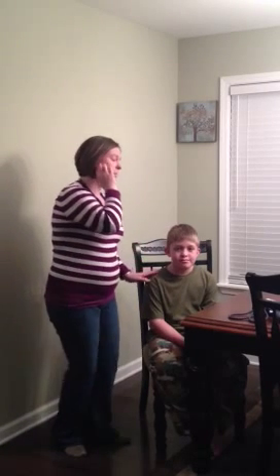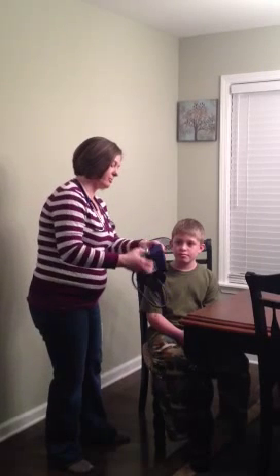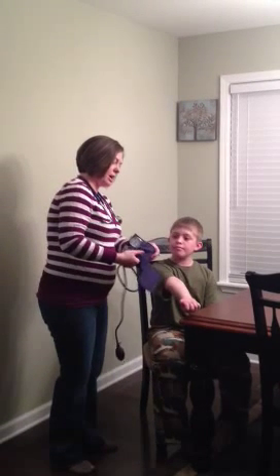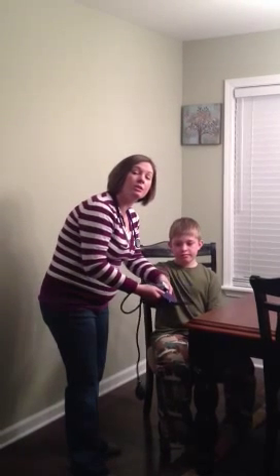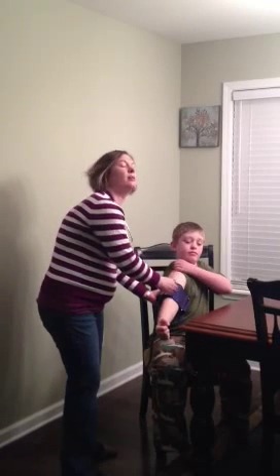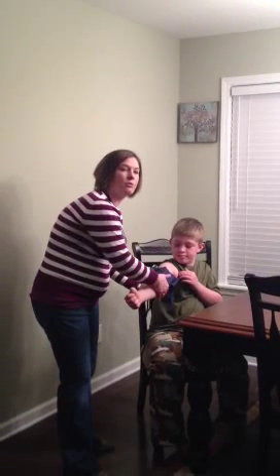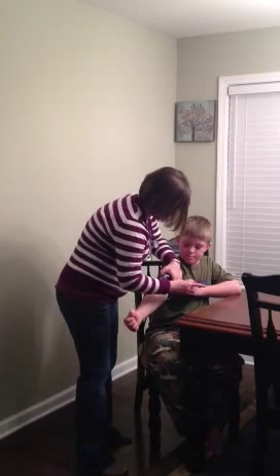And the last vital sign we're going to do is blood pressure. So we have a cuff manometer here. We're going to put this on Caleb's arm. And usually for adults, it's 120 over 80, but for children, it's lower than that. It's like 90 over 50 or over 60 is the normal. So we're going to put this on real tight on Caleb.